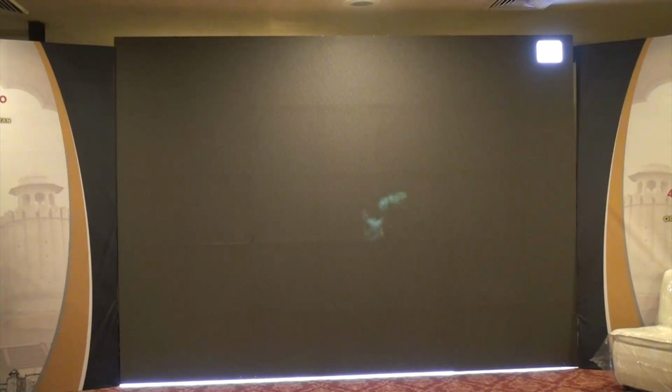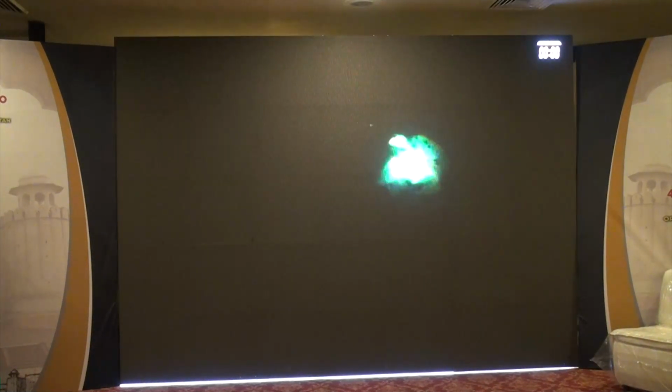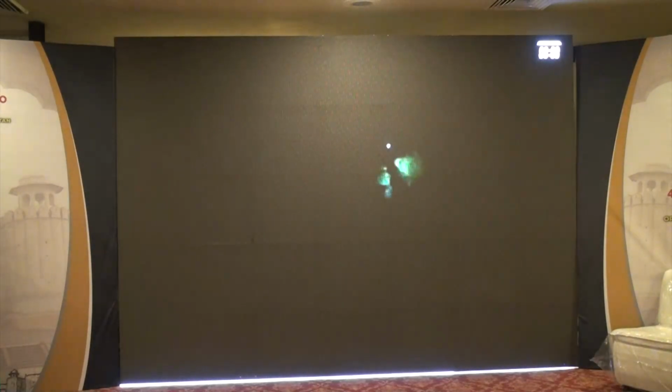retinectomy. But again, with the viewing system, you only could see the central part of the retina. As you wanted to go to the periphery, the view was suboptimal, and you weren't sure what you were doing. So the message here, from my experience, is that in these particular cases, you can only do what you see.